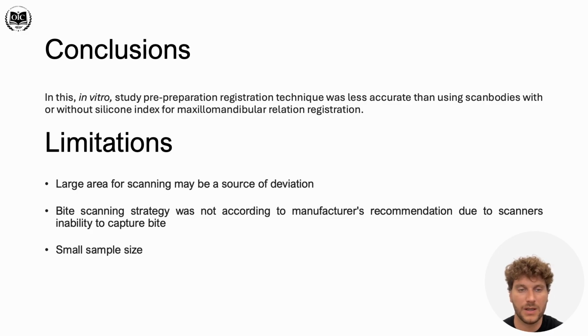But clinicians should be careful in using these kinds of methods to produce accurate bite registration in full arch implant cases.